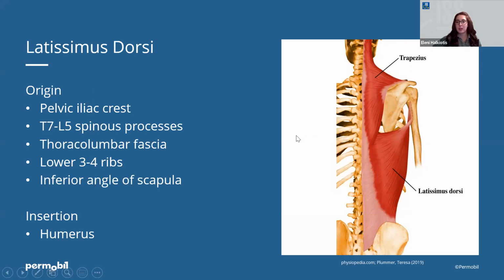further up. And think about that for our clients, manual wheelchair riders that roll into clinic that have collapsed into a posterior pelvic tilt, that are sitting with a really kyphotic posture, and then expect them to do any sort of mobility related activity of daily living requiring forward or overhead reach. They really are put at a biomechanical disadvantage for those reasons.